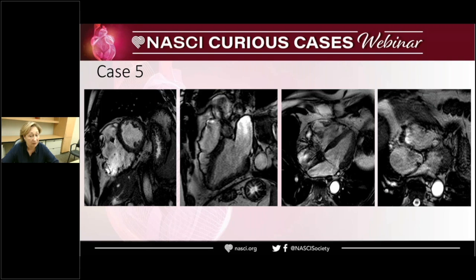Well, great. That is the case of ARVC. I'm glad that you are talking about the numerous microaneurysms. Those are probably the most extensive that I've ever seen. And I brought you this image as well to show a small aneurysm here along the septum even. I've never seen anything like that before. And then you can see this little accordion sign here, right? And then the dilation of the right ventricle as well. I'm glad that you're saying ARVC, not ARVD, both are correct basically, but what is the difference?